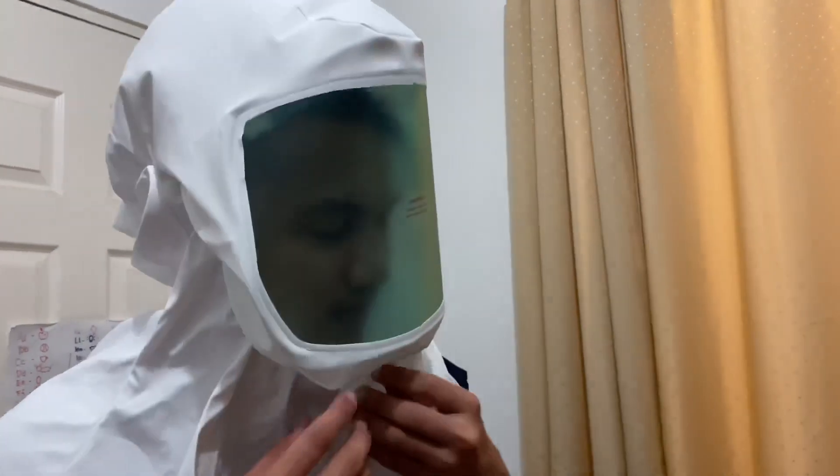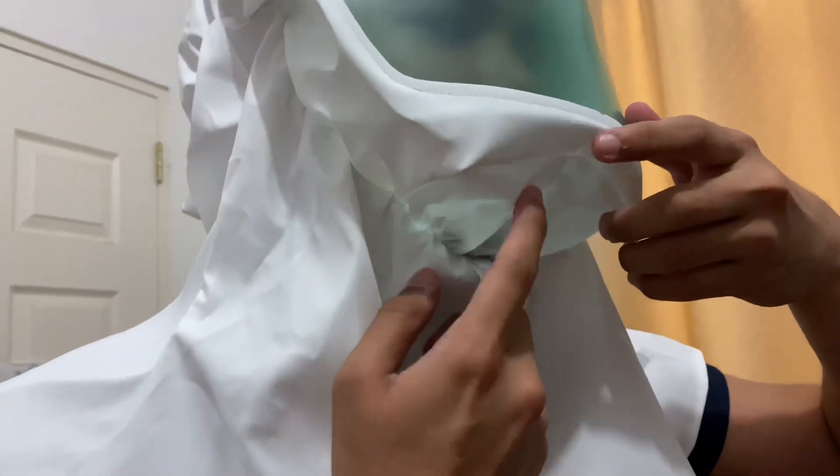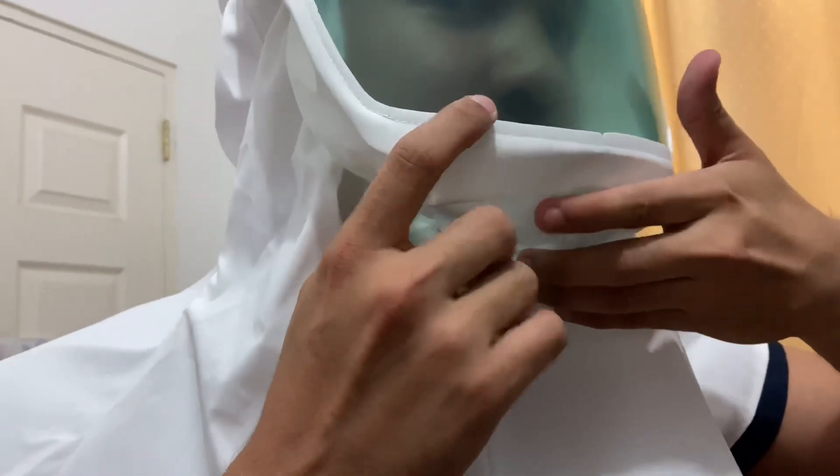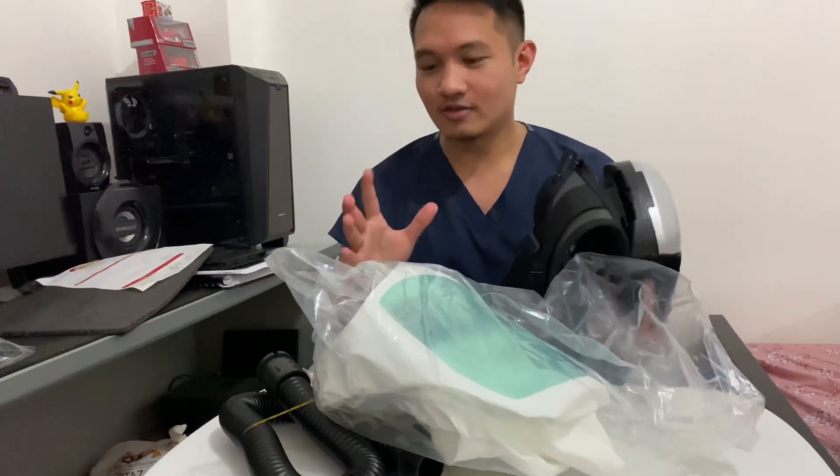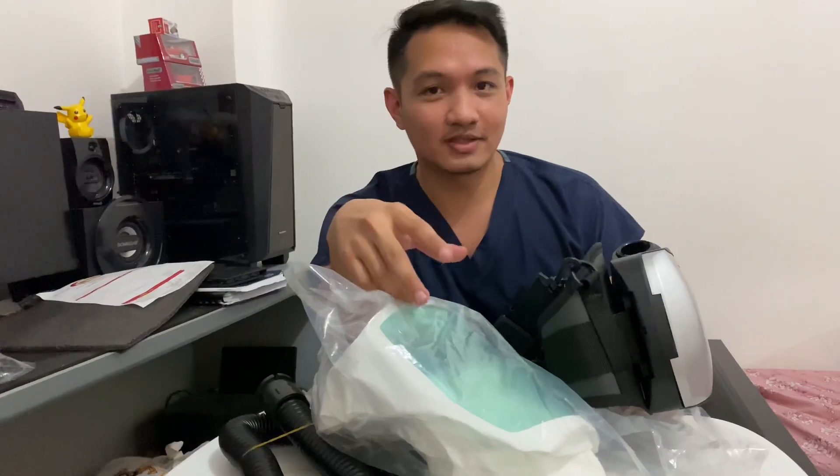I guess this is where the air goes out. You can see it here. Air goes inside this tube at the back, and then air goes out here. So it's a positive pressure inside. You don't have to wait. And regarding the cost, this one cost me 20,000 pesos.